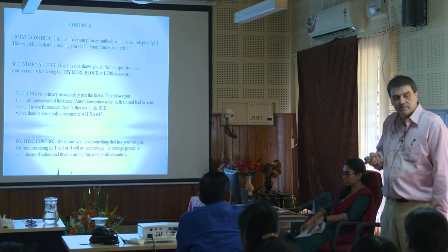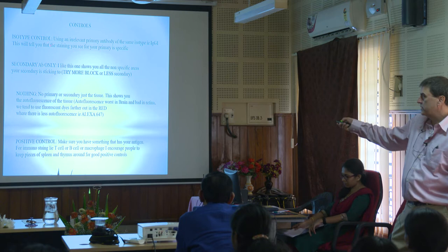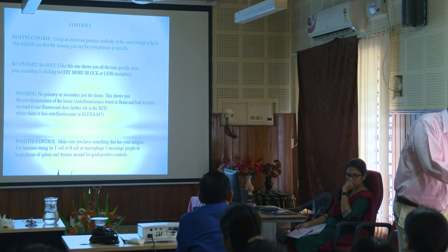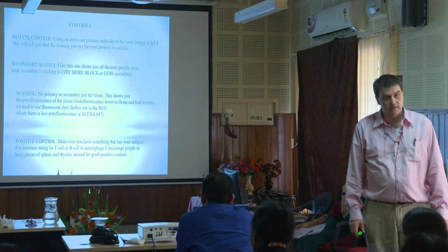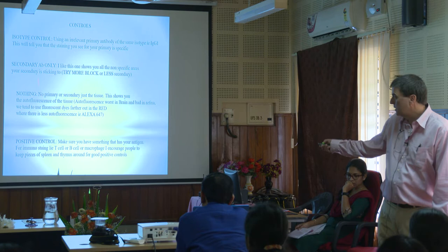So if you give me this picture, this picture, this picture, and your sample, I can usually interpret what's going on, and I can tell you, yes, it worked. But if you come to me and say, did it work, and you have none of this, I have no idea what I'm looking at. Am I looking at something totally nonspecific? I don't know what I'm looking at. You need these controls to determine what's going on.